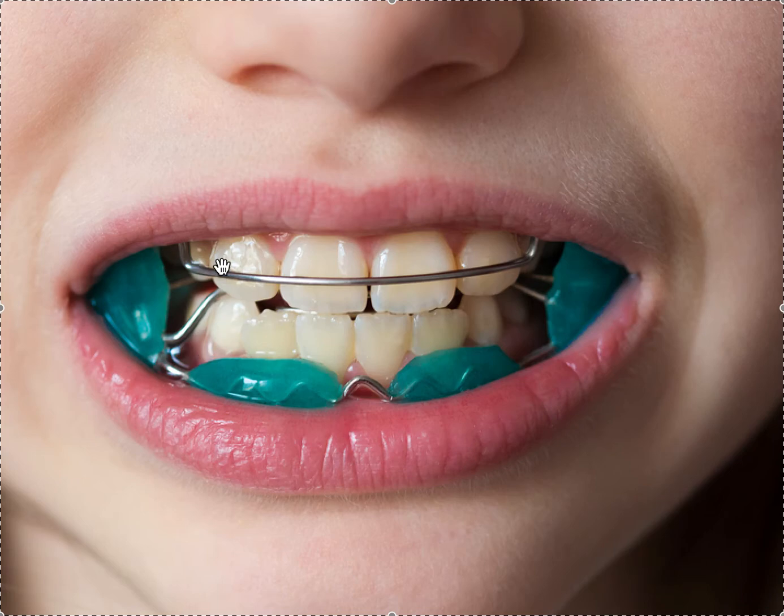The opposite version — the Class III version, or the Frankel 3 — is going to be the reverse. The pad is up top, allowing the tongue to flare the upper incisors, and the bow is down below, not allowing the lower incisors to move forward. I'm not sure it works as well. I would still prefer reverse-pull headgear for Class III, because there is an actual force being applied to the upper jaw, but it's definitely an option.